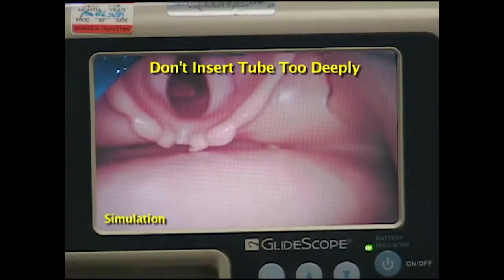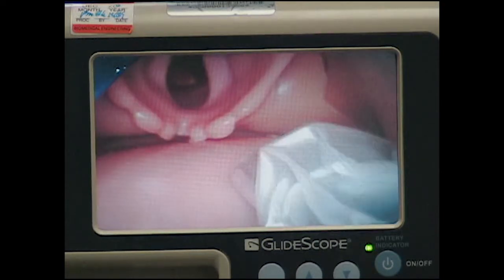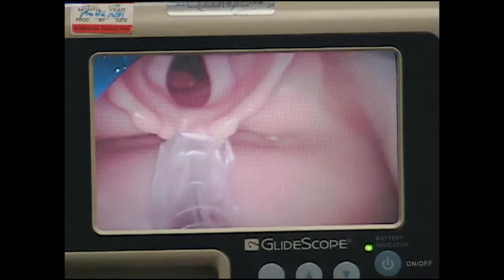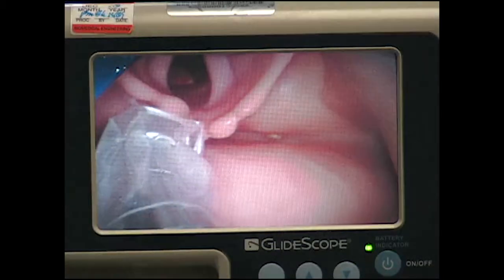Don't insert the tube too deeply. Since the focal length of the lens is short, the larynx is a lot closer than it appears. If the tube is too deep with the tip very close to the larynx, rotating the tube forward will tend to place it into the esophagus.